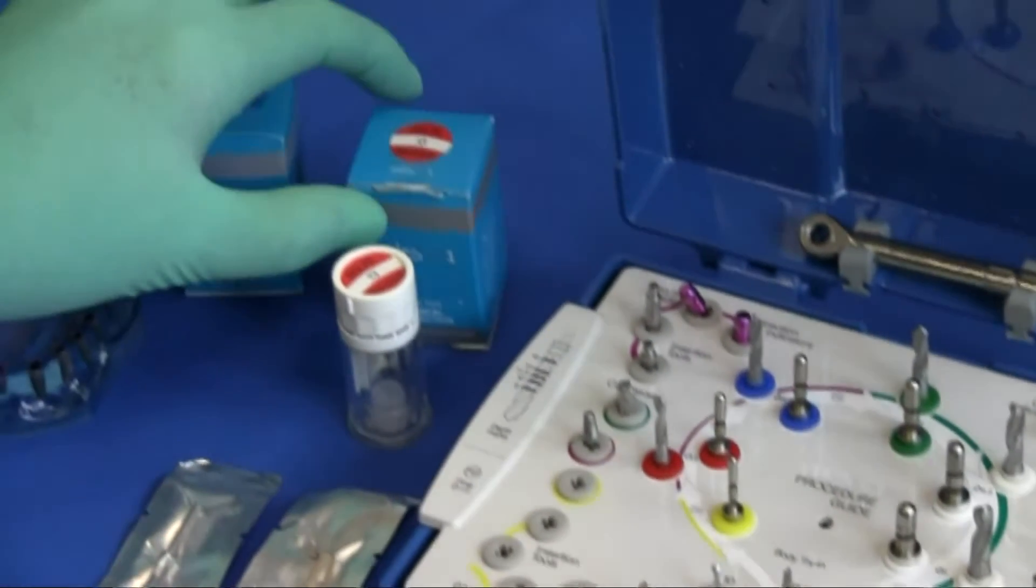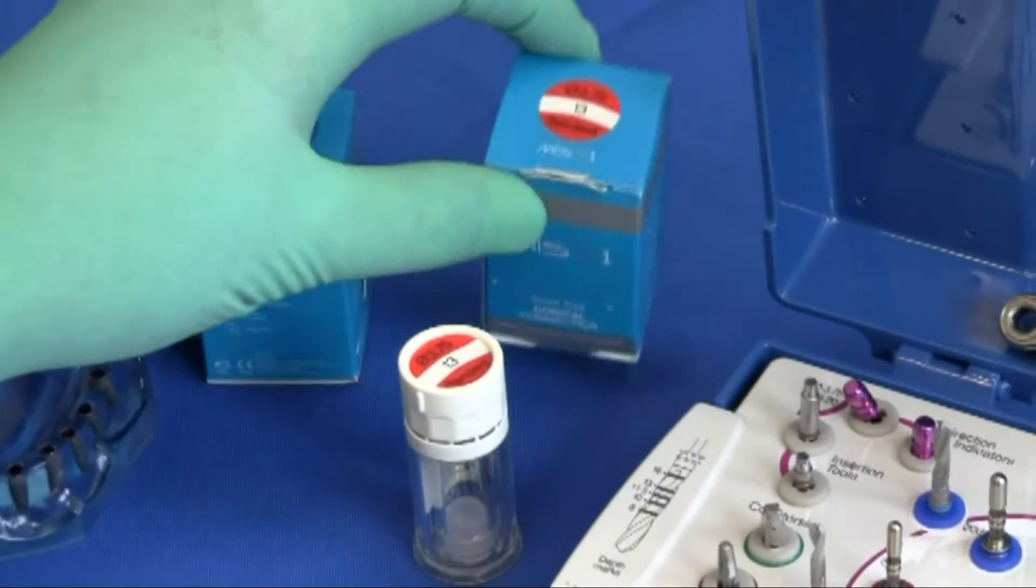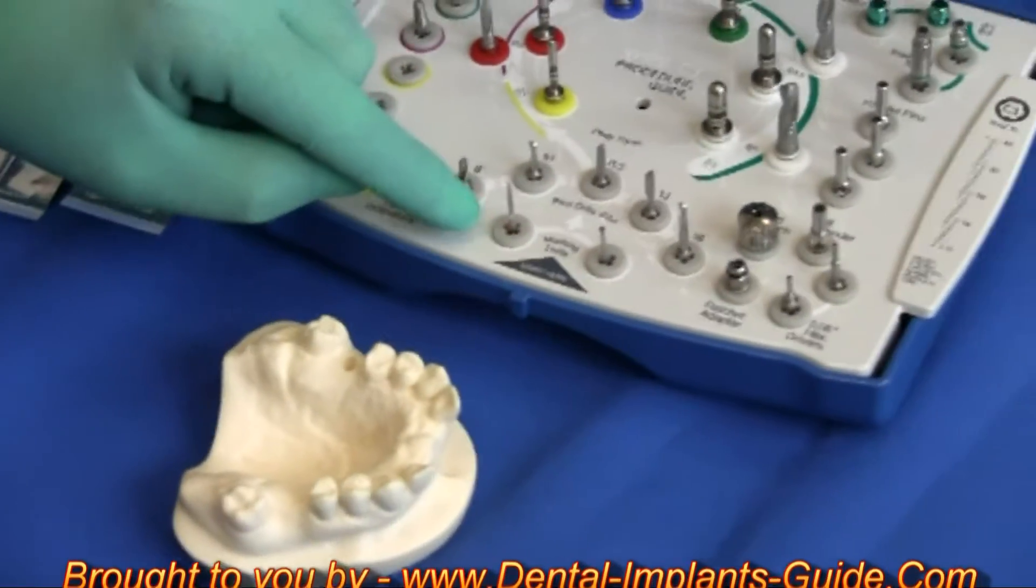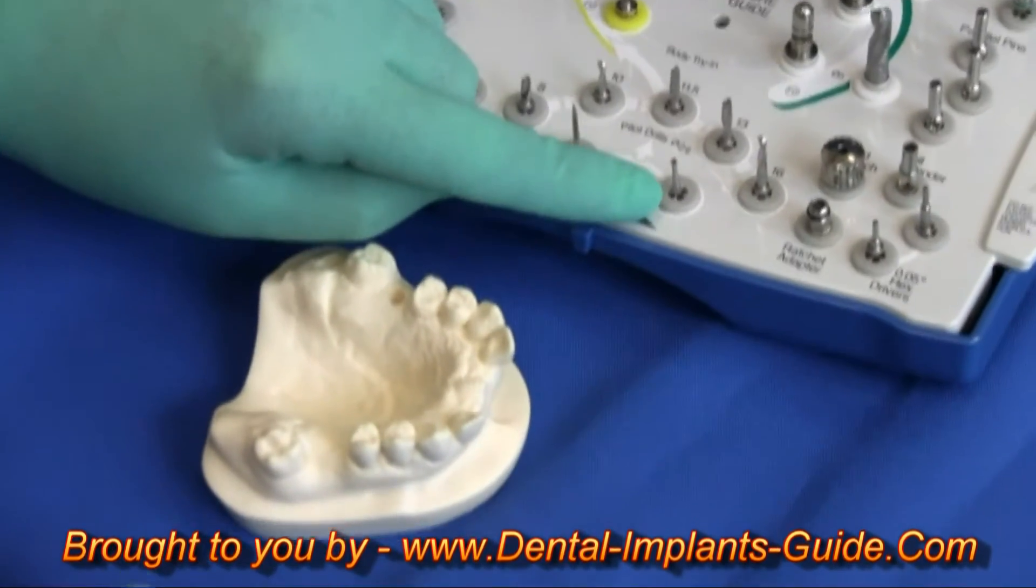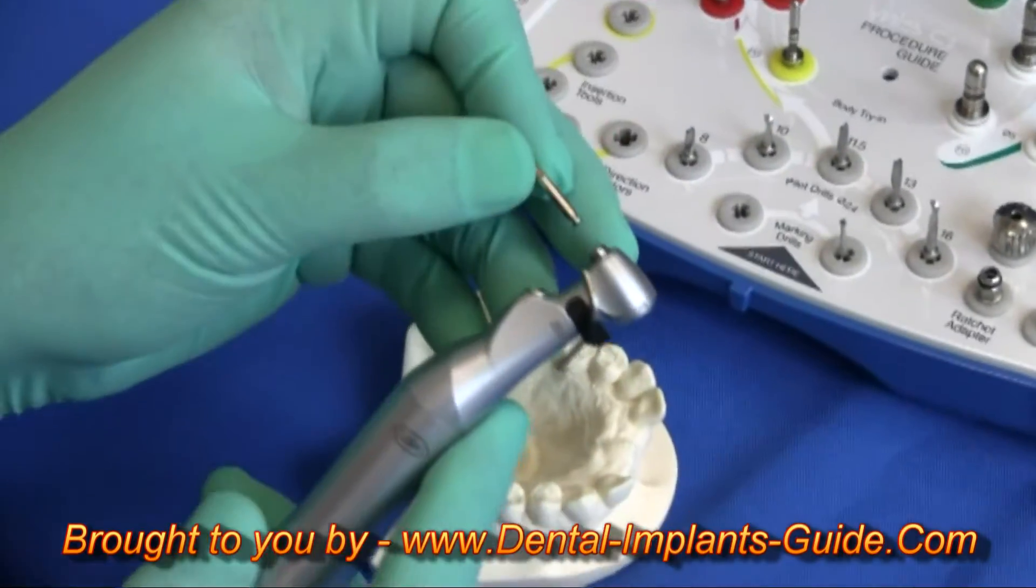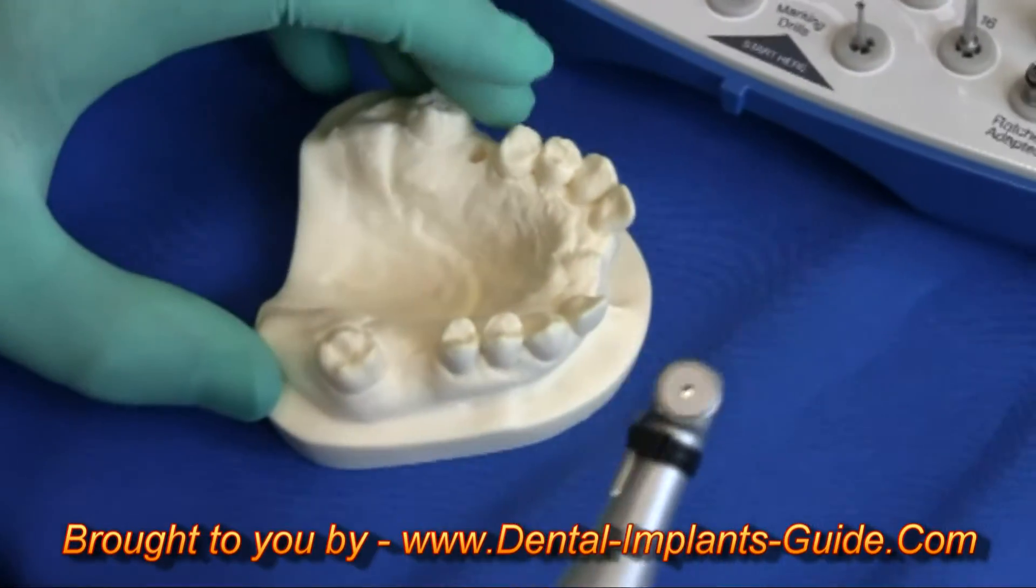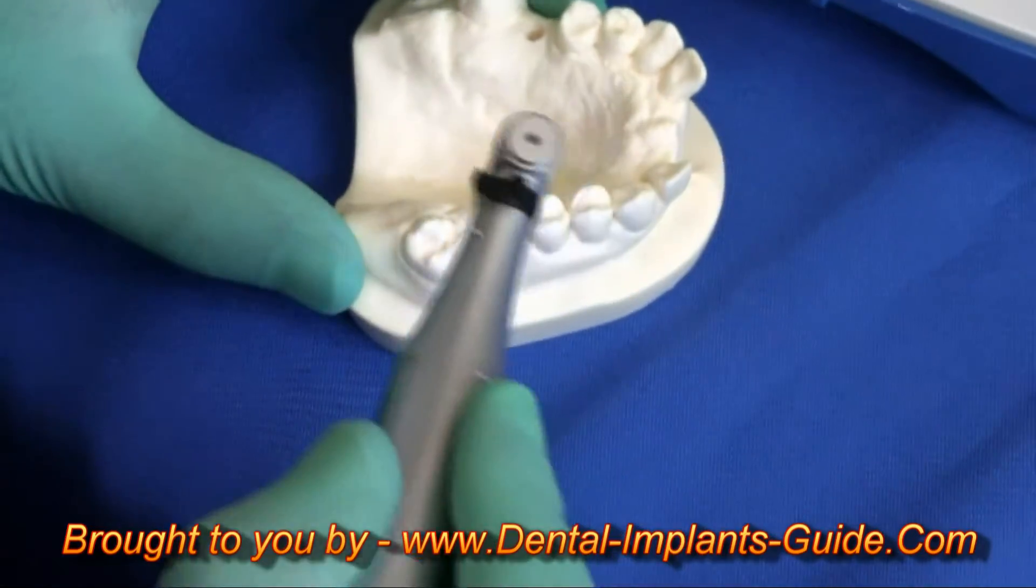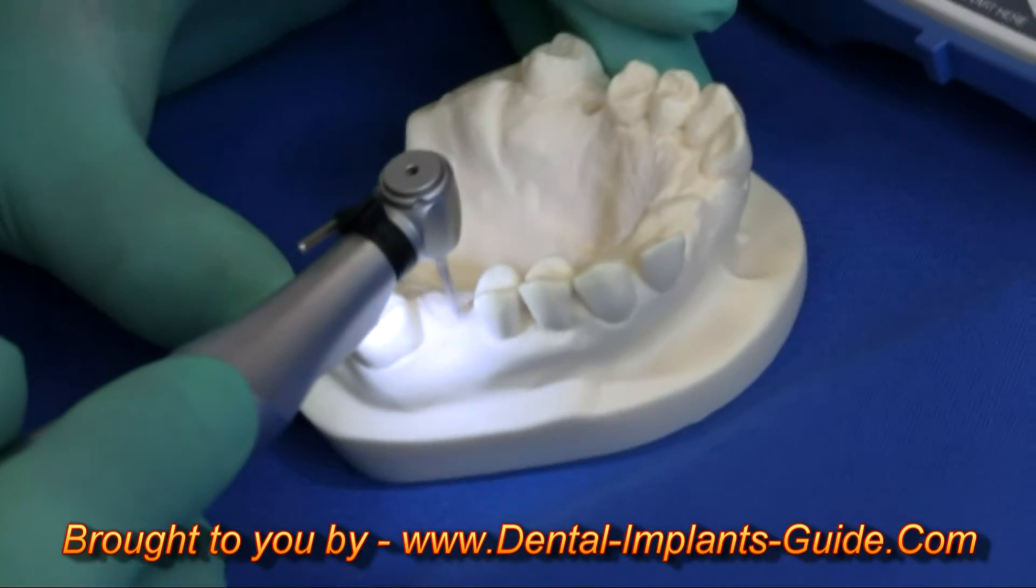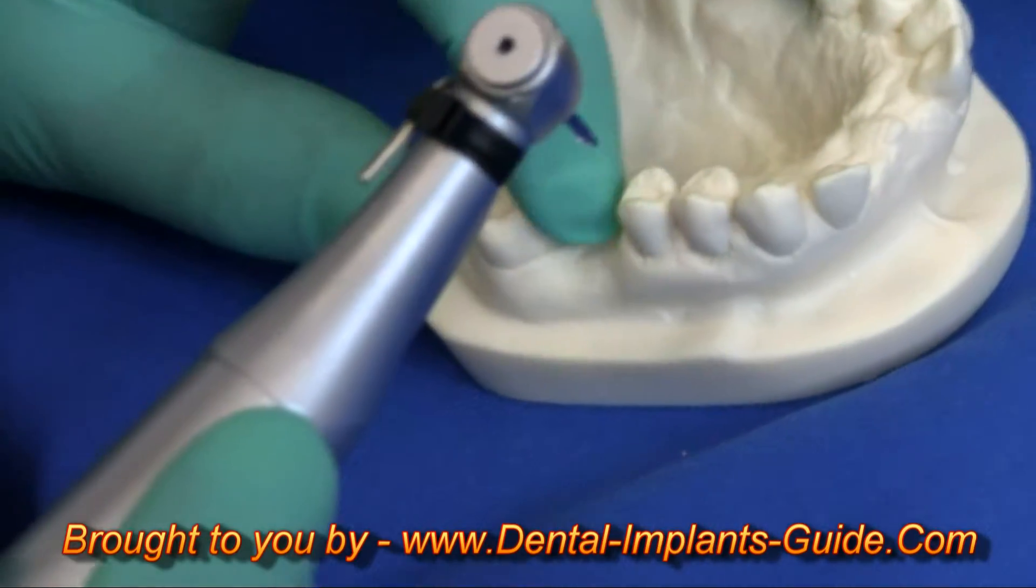I'm going to place a 3.75mm by 13mm length C1 implant. First, I would want to mark the site using either our Spade Marking Drill or regular Marking Drill. I'm going to use the Spade Marking Drill, just enough to mark the place on the bone.